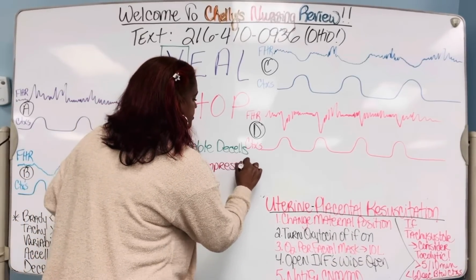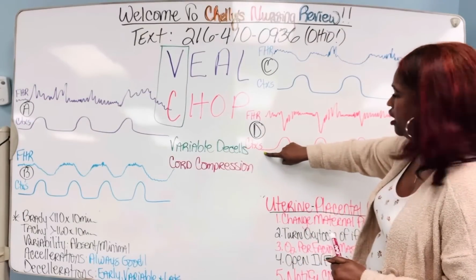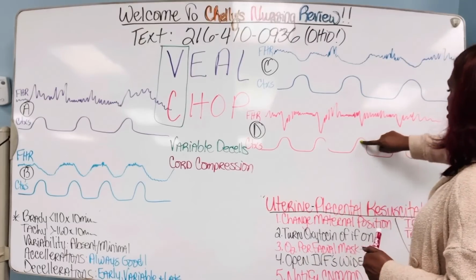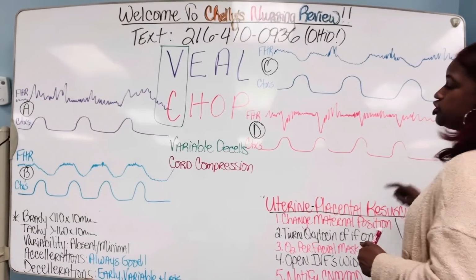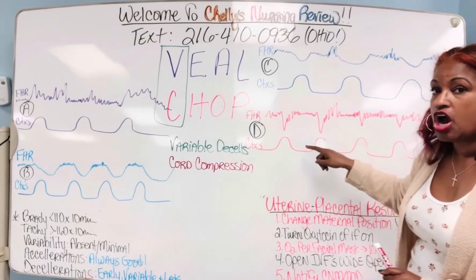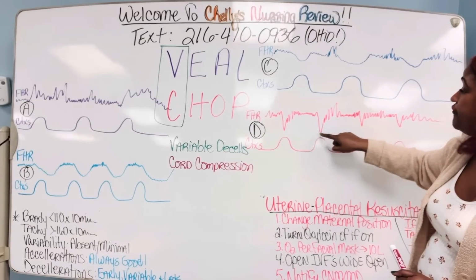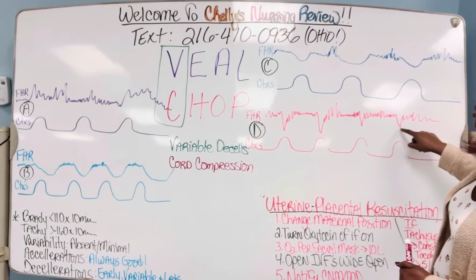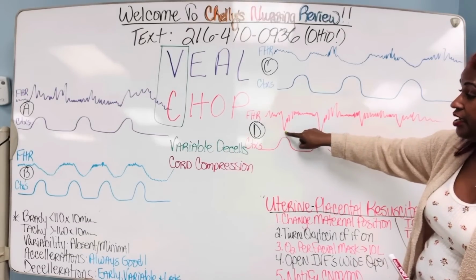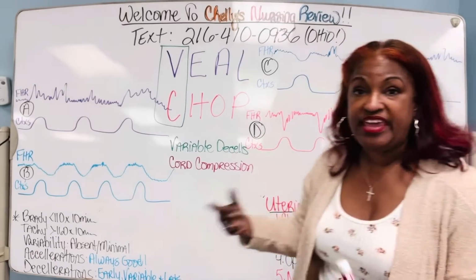These are the easiest ones to locate on the test, because if you look at the contractions, 1, 2, 3, 4 contractions, the fetal heart rate dipped down in the shape of a V each time, and the lowest part, or the nadir, of the V matches the peak of the contraction.